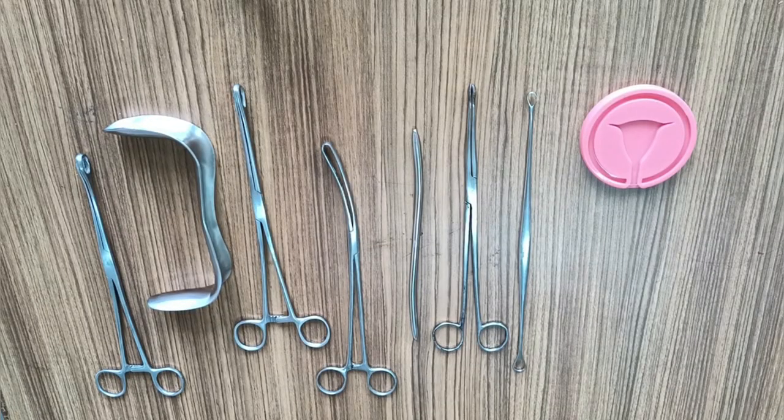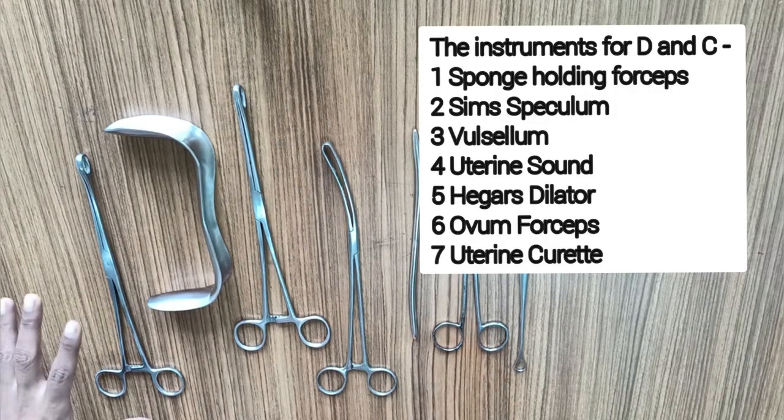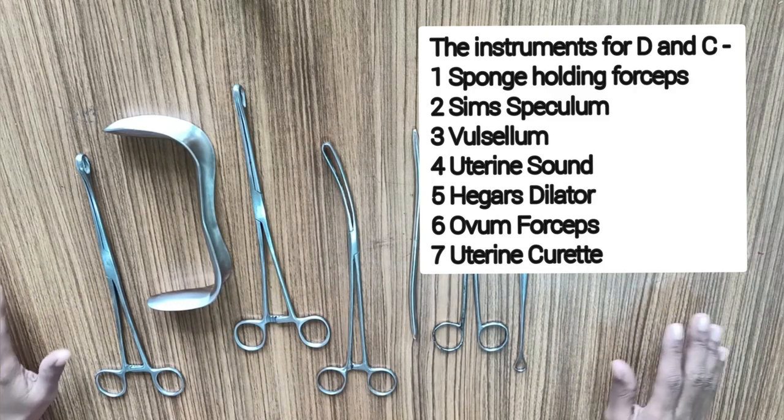Hello and welcome to the channel Love Obstetrics and Gynecology. This video is about the instruments that are required for the dilatation and curettage process. I'll be taking instruments one by one as they are required for the procedure.